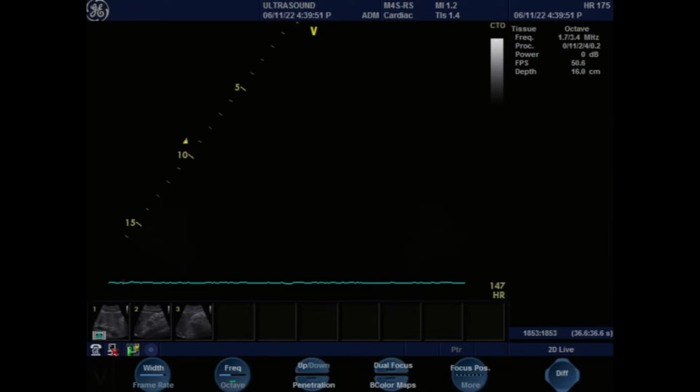status. You hear this all the time: what is the IVC size? Is the IVC large, is it small, is there respiratory variation? That's something very easy that everybody can do. If you can get your hands on a probe, and somebody comes in short of breath, do they have congestive heart failure or not? As a non-cardiologist, you can look at an echo and maybe say that the heart is not working properly, or maybe it is, you're not sure, but you can very quickly identify the volume status of the patient by doing a quick IVC, which is very simple.